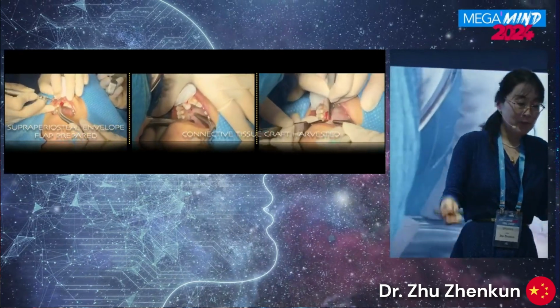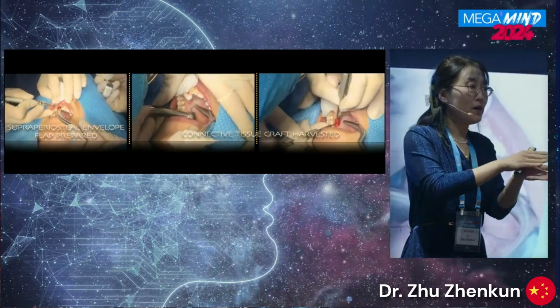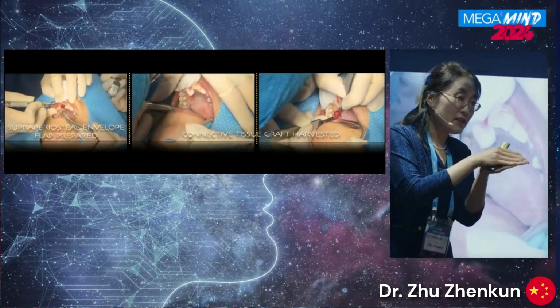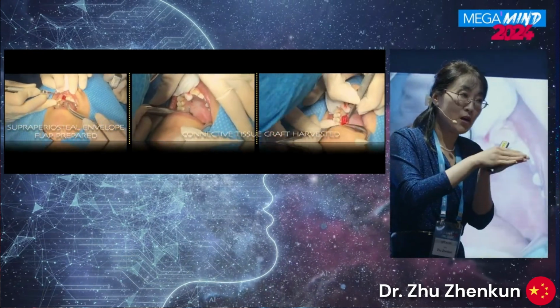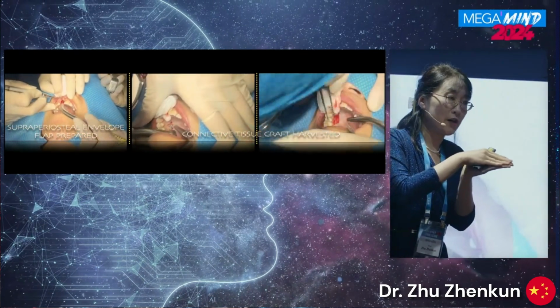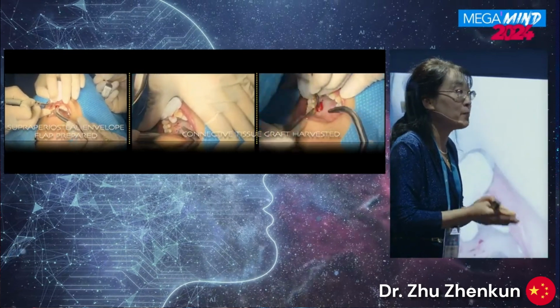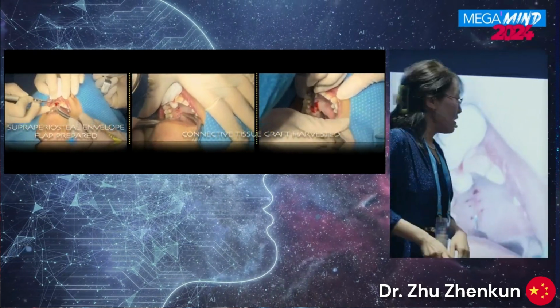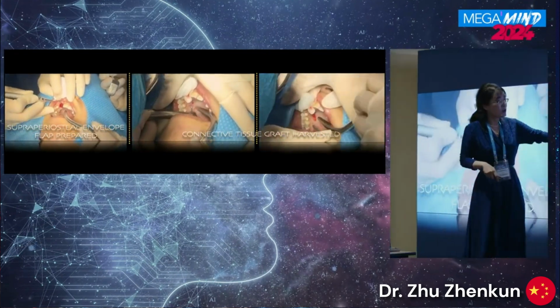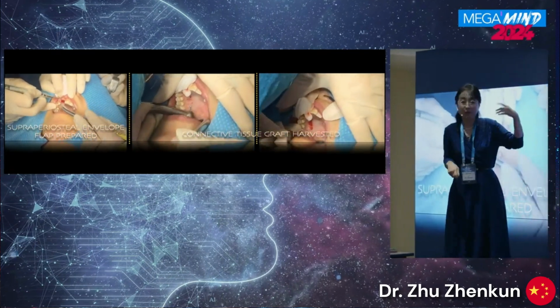Intimate contact with the biolaminar or soft tissue complex is achieved, and this helps to maintain the graft survival and control the post-operative bleeding of the soft tissue. Once this step is done, we harvest the connective tissue graft from the palatal.